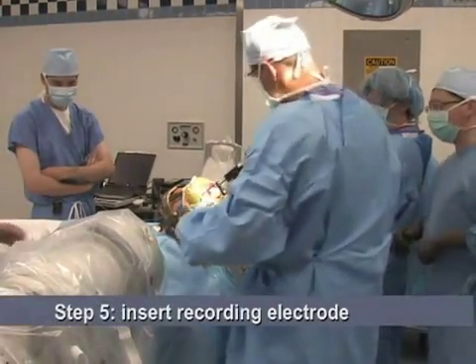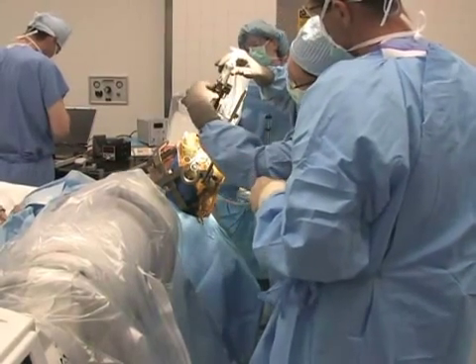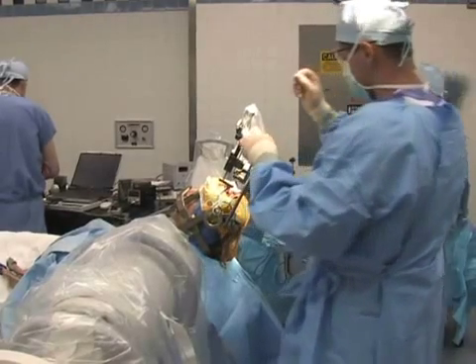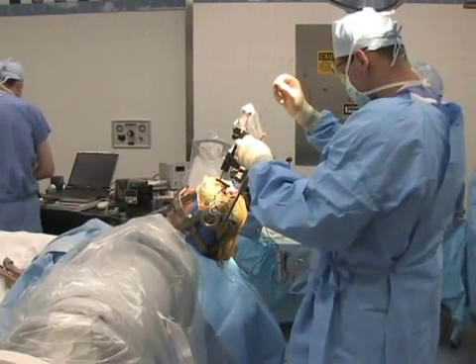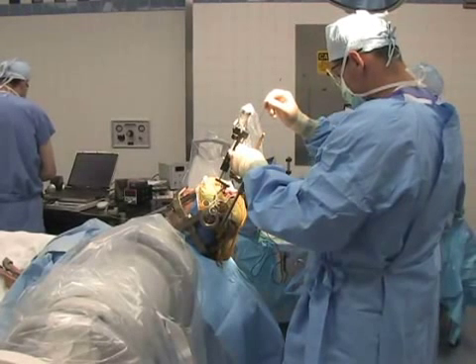Next, an arc-shaped device is attached to the head frame. The electrode driver is attached to the arc. Then, based on calculations from the planning computer, the recording electrode is inserted to a specific depth and angle inside the brain.